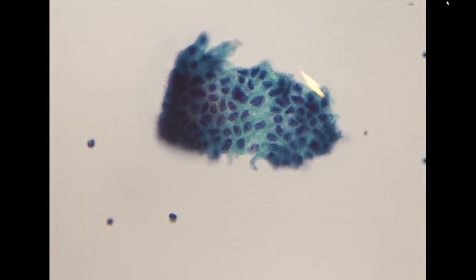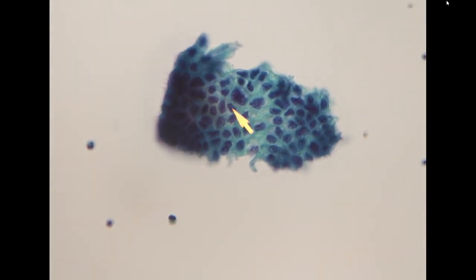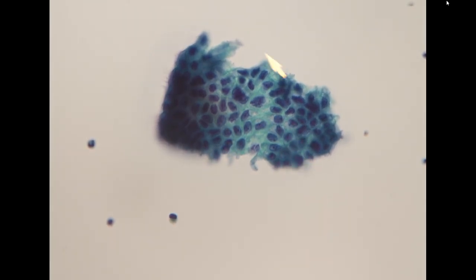In this cluster, despite the relatively small size of the nuclei, you can tell that the long axes of the nuclei are crossing each other, which suggests disorganization, in contrast to the well-organized honeycombing cluster.